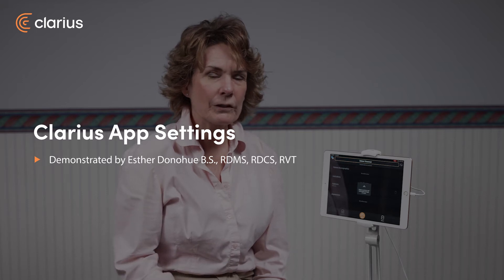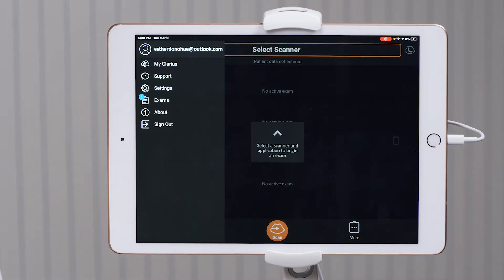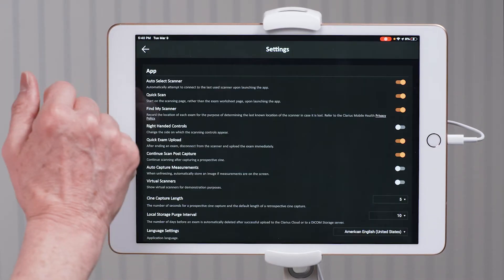Hi, my name is Esther and I'm going to be showing you the settings in the Clarius app. These settings will allow you to be more efficient and also give you longer battery life. To get to the settings, you press the menu button in the upper left-hand corner, then you select settings. Once we're there, the first three are already turned on and I recommend that those stay on.